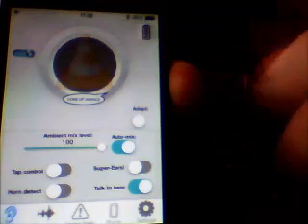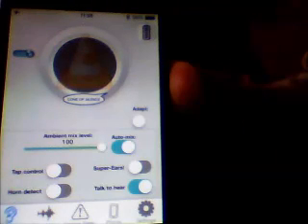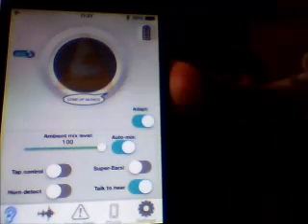This icon here, tapping on the button, enables or disables the directional enhancement system of the earphone system via a Bluetooth low energy command. This button here is the adapt button that sends a BTLE command to the earphone hardware to retrain the target location for the directional enhancement system.